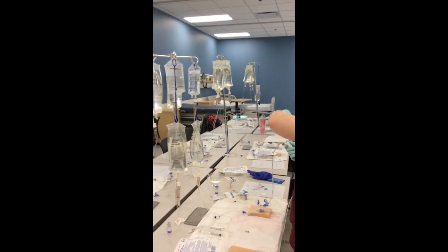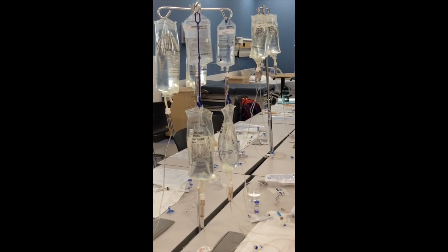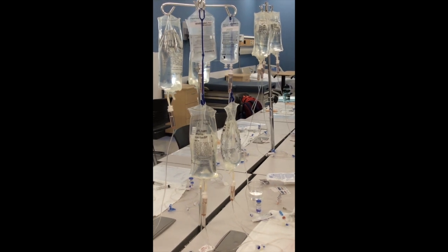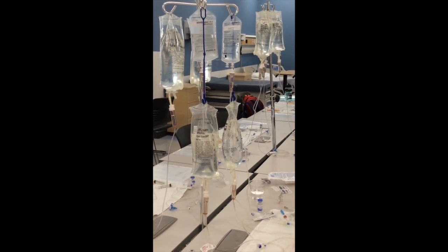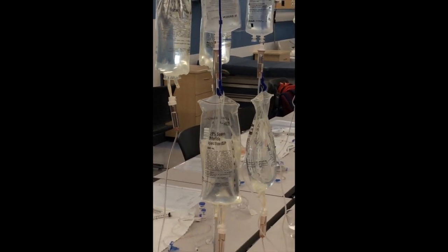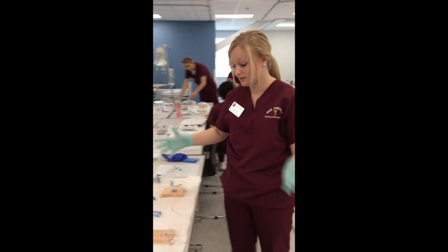Make sure I've got my 5 drops. Alright, so I've got my drop rate calculated and everything's infusing well.